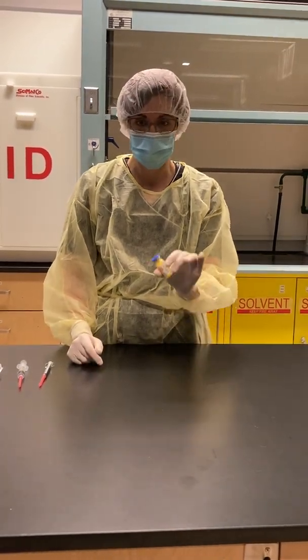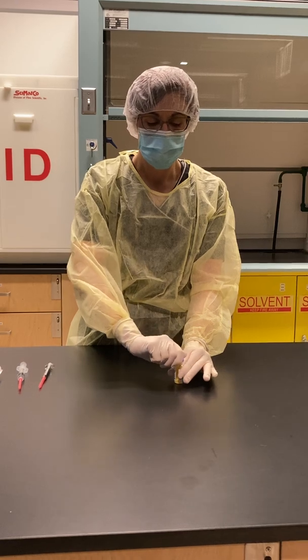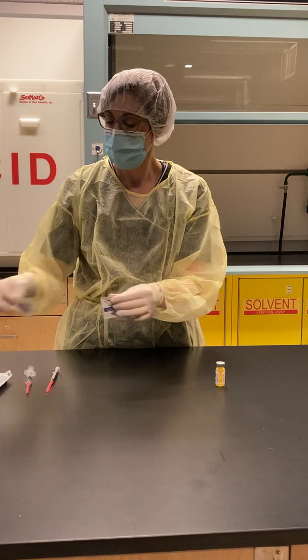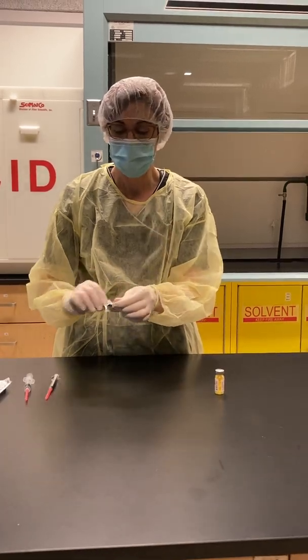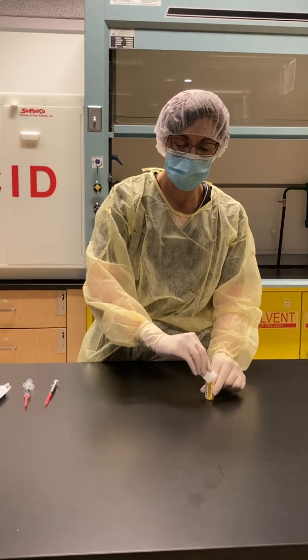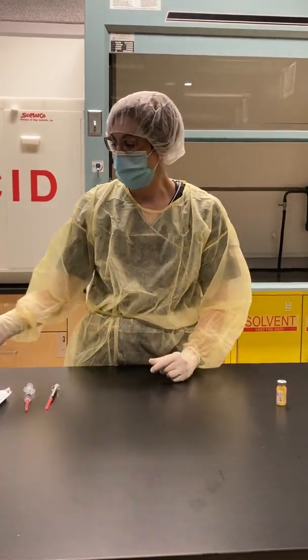I'm going to bring my drug into my work area, flip off the cap, take my alcohol swab, swab it three times, and let it dry.